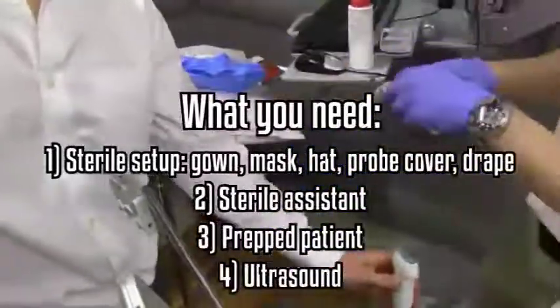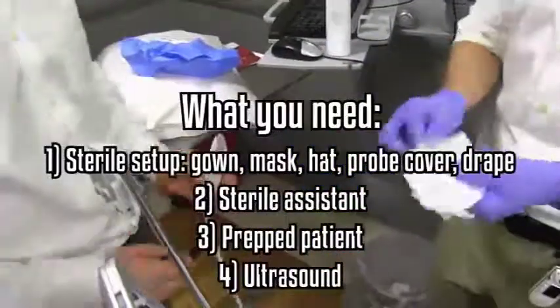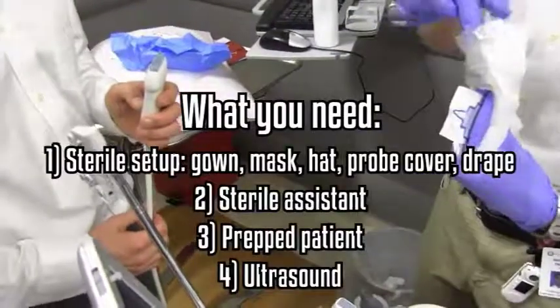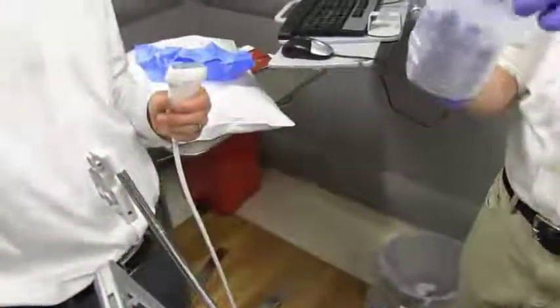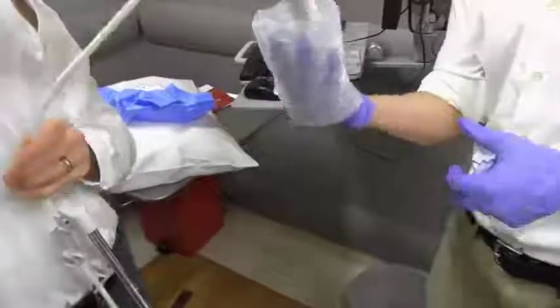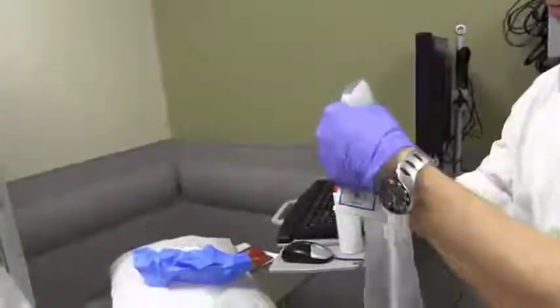Once they've handed you your sterile probe cover, you'll have them place non-sterile gel onto the vascular probe. You'll want to open the probe cover so that you create a cup with your hand for the assistant to place non-sterile gel in. After placing non-sterile gel in this cup, they will then insert the probe into the cup for you. You can then pull the sleeve down yourself because the sleeve remains sterile.